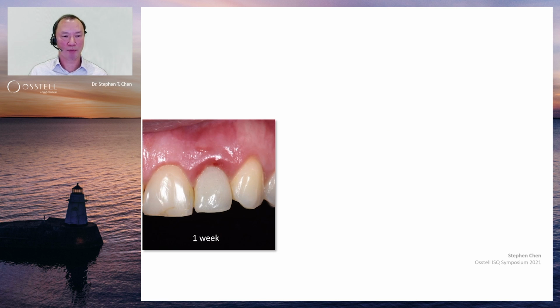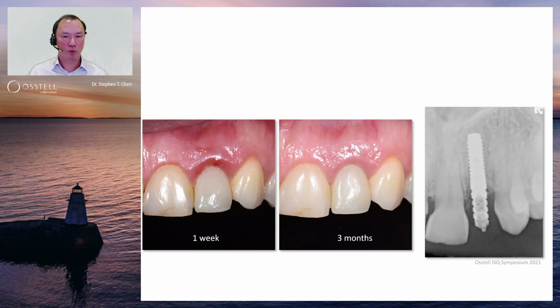So the patient went back to the referring prosthodontist to have a provisional crown connected based on the index of the impression that was taken, of the implant that was taken at the time of surgery. So this is the 1 week follow-up. The resorbable sutures were used to stabilize the soft tissue margins, and now they have resorbed and have come away. That was 1 week, and this is 3 months. You can see clearly the provisional restoration in place, and everything is going well.